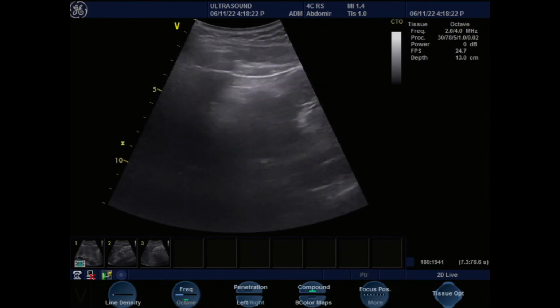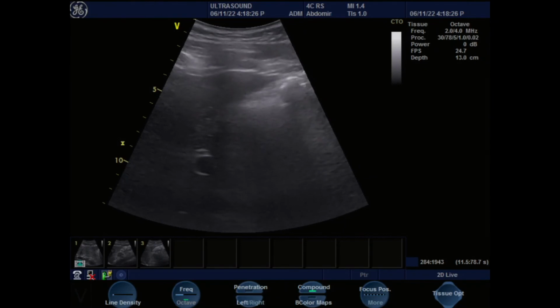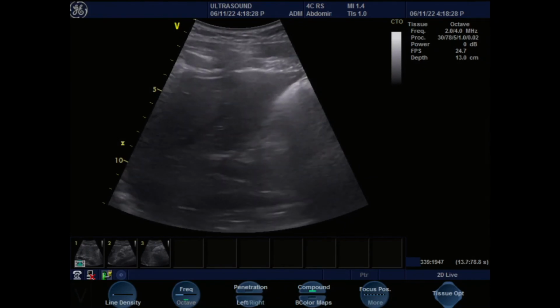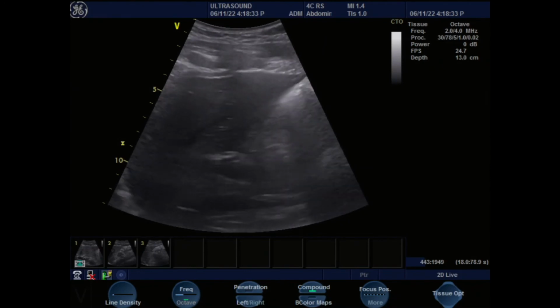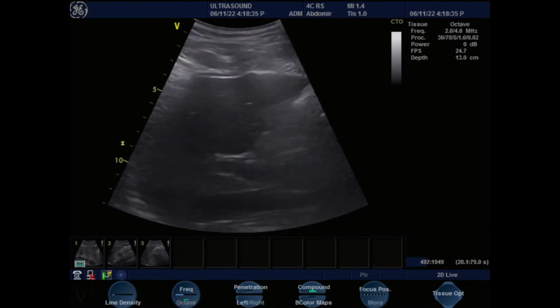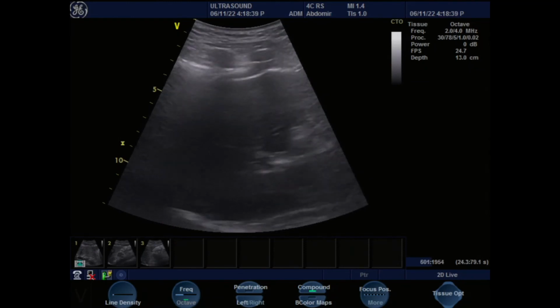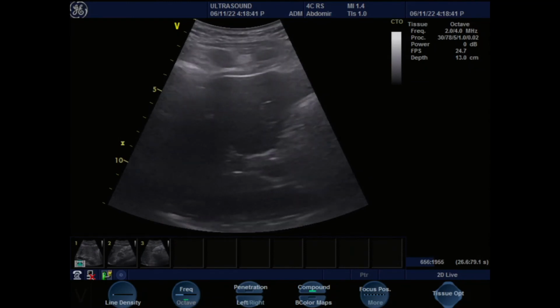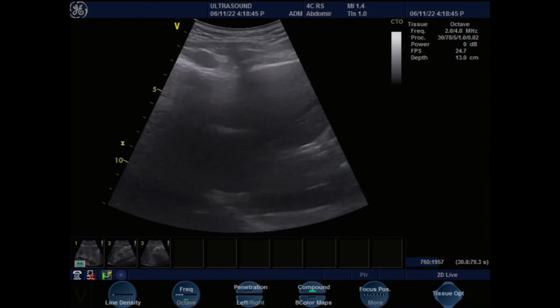So that was a little move like a gallbladder, go a little, there you go. Now you see it leads in and out. So move more lateral, move more intercostal. Okay, so now we're losing that. So what you would need to do, just breathe normal.